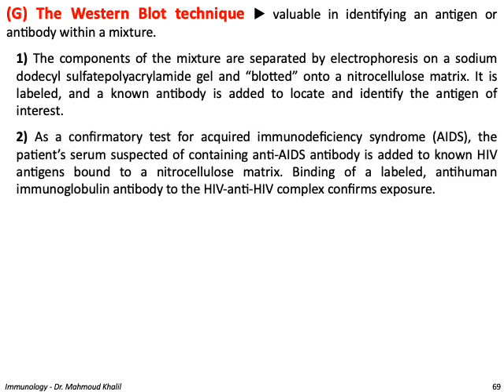It can be used as a confirmatory test for AIDS. The patient's serum suspected of containing anti-AIDS antibody is added to known HIV antigen bound to nitrocellulose matrix. Binding of labeled anti-human immunoglobulin antibody to the anti-HIV complex confirms exposure.